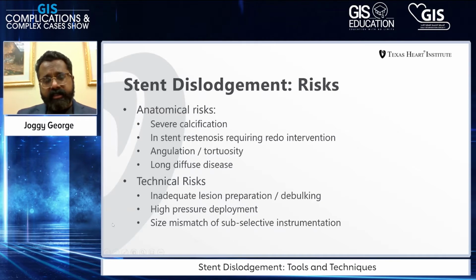So in this case, in-stent restenosis was, of course, an issue. And the subtotal nature of the lesion was also an issue. And presumably the gentleman had calcified disease distally, that of course played a role in the left main.